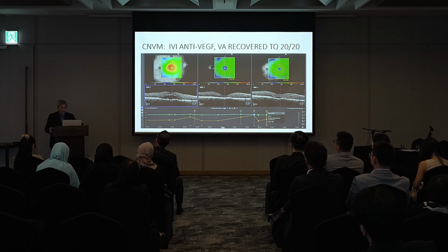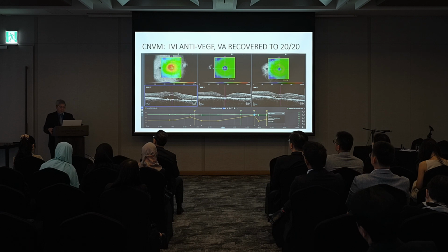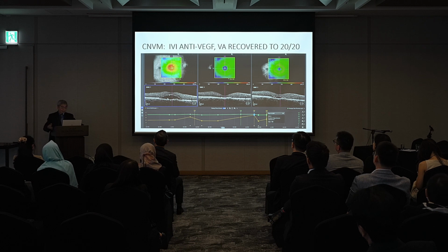On the OCT, we explained to the patient that they had subretinal fluid, and this red area is the area with swelling. And because of our OCT angiography findings, we concluded she probably has an abnormal blood vessel there that's leaking, which we would not see if she had central serous retinopathy. And this prompted us to initiate anti-VEGF treatment, and she actually responded, and we're still treating her for now as a treat as needed protocol.